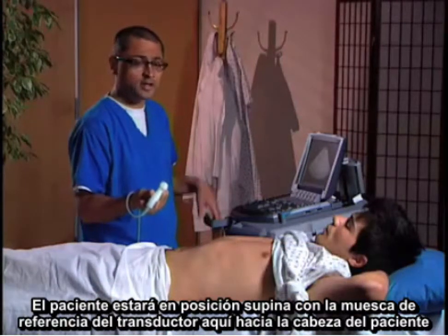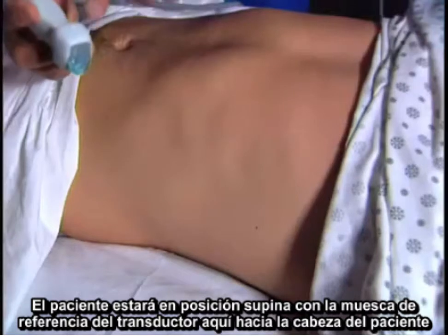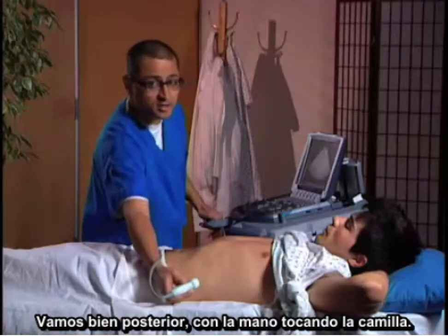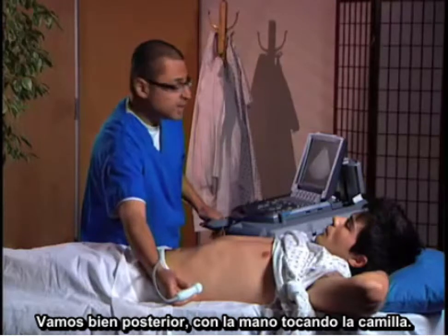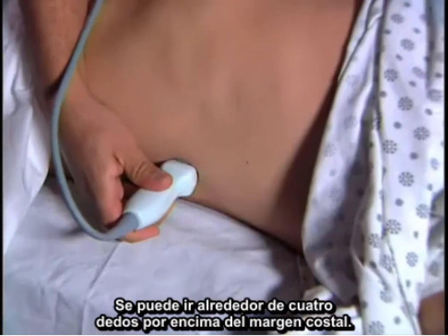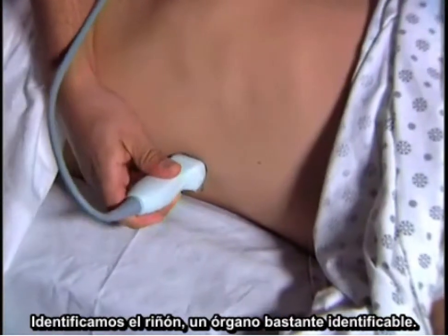We're going to start again with the patient supine. This is the probe marker right here. We're going to go really posterior — my hand is going to touch the gurney, and you can go about four finger breadths just above the costal margin.